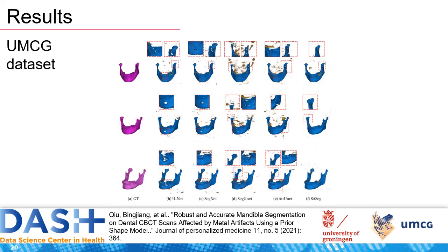Here is the result. The above-mentioned methods have problems with over-segmentation or under-segmentation while addressing the dental CBCT scans. But our method can precisely segment the entire mandible structure, even if the metal artifact appears.